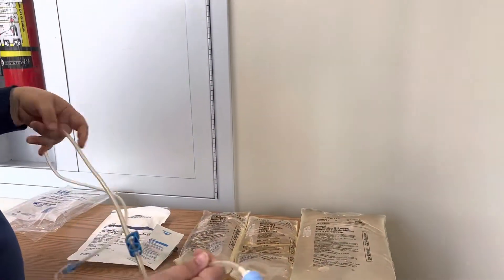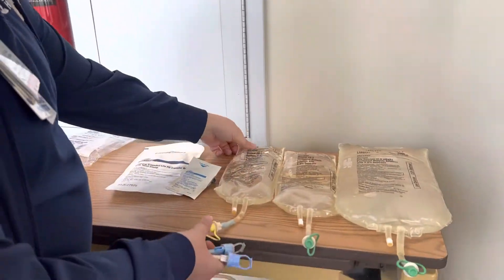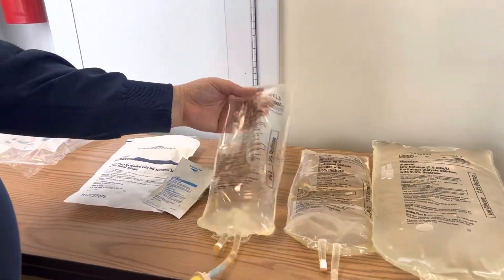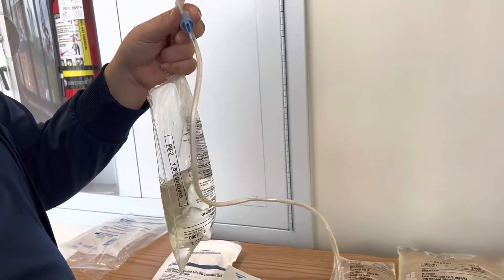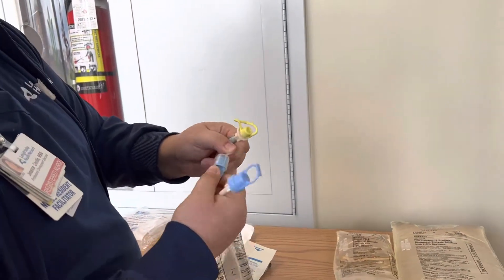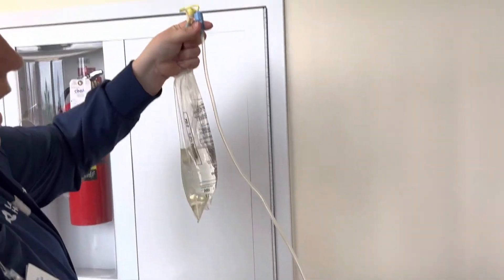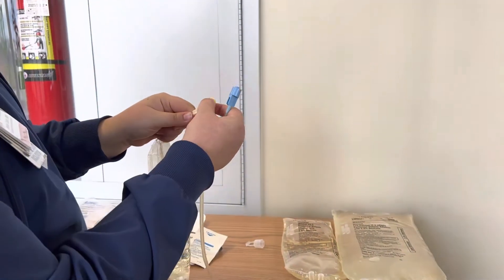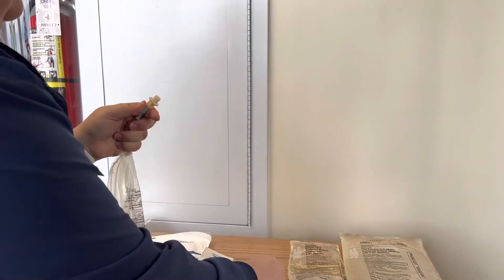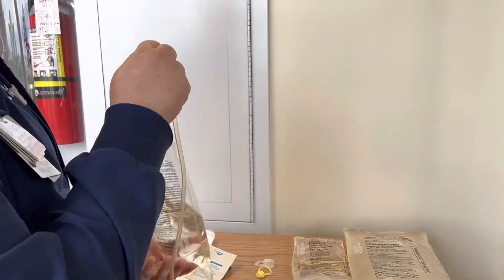We will first start with connecting the solution. Let's say we're going to be giving this 1.5% dextrose solution. Make sure the clamps are closed, take off the cap of the longer part of your Y, and you're going to pull the cap of the solution — this just screws right on into the end.